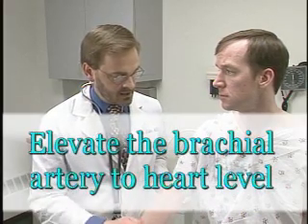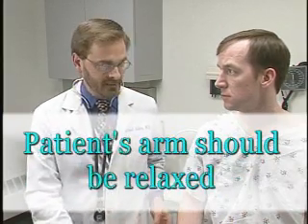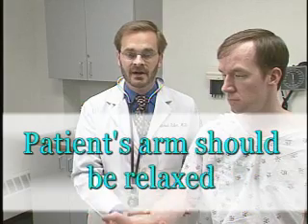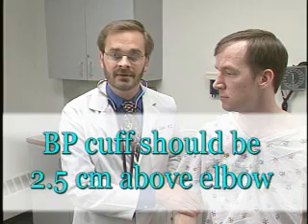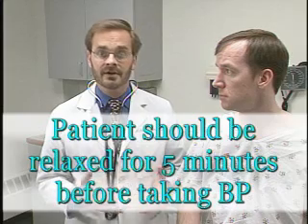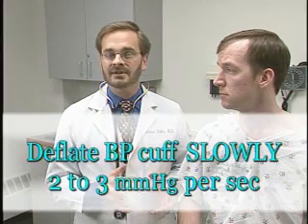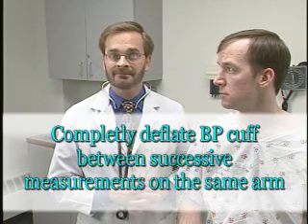Third, not elevating the arm or the brachial artery to the level of the heart would cause an error. Fourth, if the patient just held their arm up themselves, they'd be contracting their muscles, and that would falsely elevate blood pressure. So again, you as a physician need to help elevate their arm to heart level. And also, if the cuff is too low on the arm, you'll occlude the brachial artery and it will be difficult to hear it. Next, if the patient's not relaxed, if they're upset or crying. And then if you deflate the air from the blood pressure cuff too quickly, the air will move down so fast you won't be adequately able to tell where the diastolic and systolic blood pressure actually are.